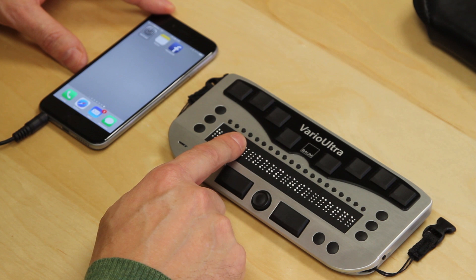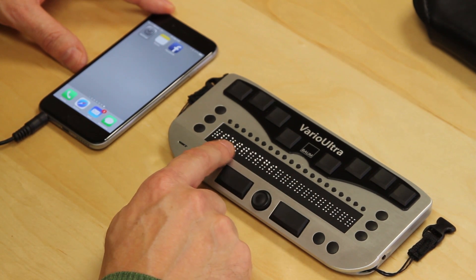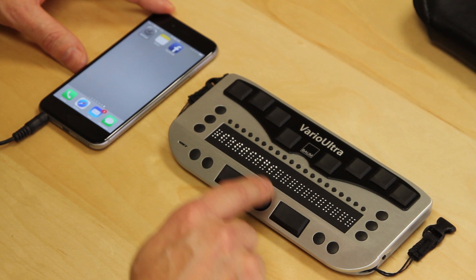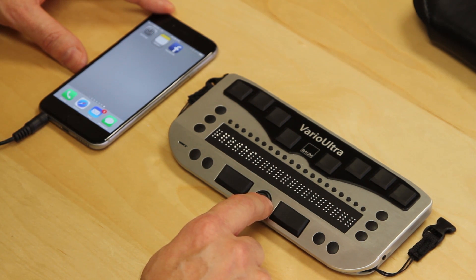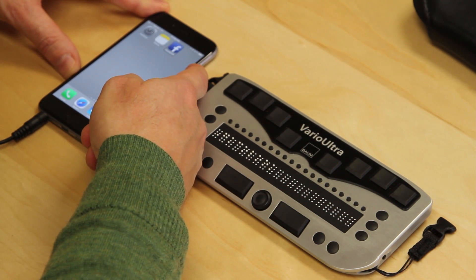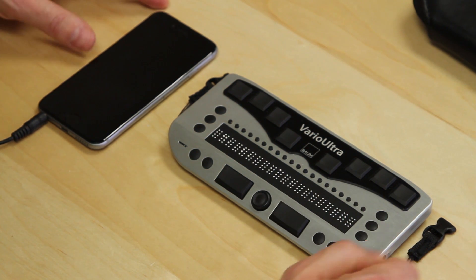I use the fingerprint to go into the device. It's now displaying the word settings on the Braille display, which is the icon we're in. Using the NaviStick I can navigate to notes, Facebook, and double tap to open. We are now connected once more. When we're ready to leave, we press the power button of the phone — Vario Ultra vibrates to indicate the connection has been lost — and then we can switch off the Vario Ultra.